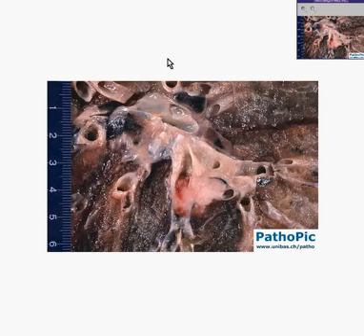The classical primary lung cancer is also the one that will be mentioned first whenever somebody rattles off the different types of lung cancer, and that's the squamous cell carcinoma. And classically, they start in the areas of the lung which have squamous cells or squamous metaplasia, which is usually large bronchi. And if you're lucky, you could see a large bronchus here, and it is obstructed by a tumor that shows infiltration into the surrounding tissues.